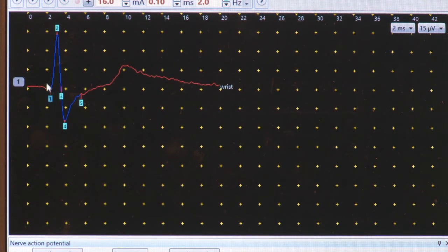And you notice immediately that the potential that is stored turned blue. And now there are some markers that have been put marker number one as to where the nerve starts to getting excited here. That means it took from this point to that point for the electrical impulse that I delivered at the wrist to reach the nerve. Then that's the maximal amplitude of the nerve. That's marker two. And that's where the nerve comes back. Action potential comes back. And that's four and five and is where the nerve stopped being stimulated.